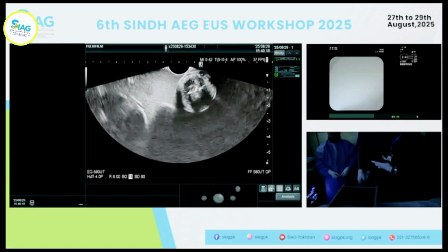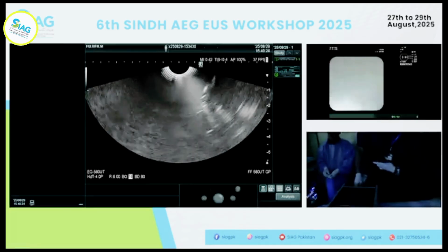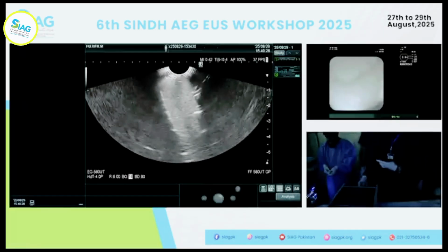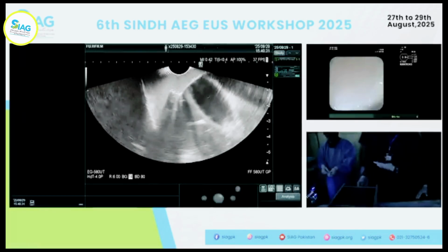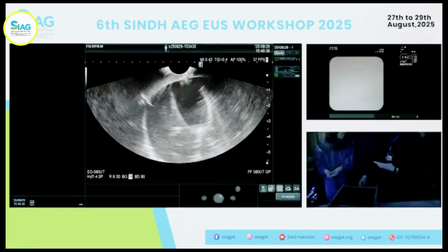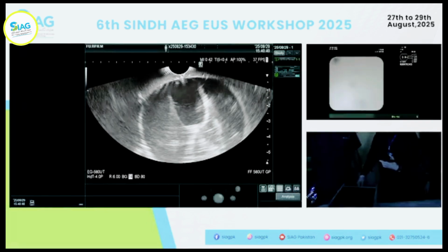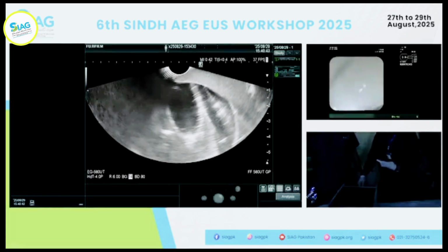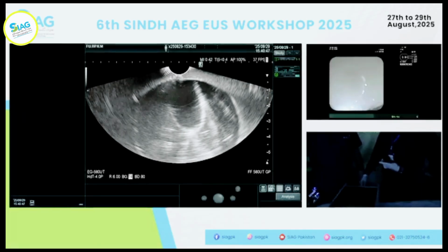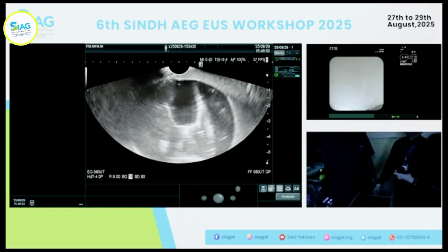Okay. So you can actually see things there. There's another thing, and you go to your cyst and you can actually aspirate. Yeah. Okay. So the important thing is positioning, right? Where is the needle going to come out? It's going to come from here and it's going to go like this, right? So you really need to have your cyst in a good position, closer the better, right?